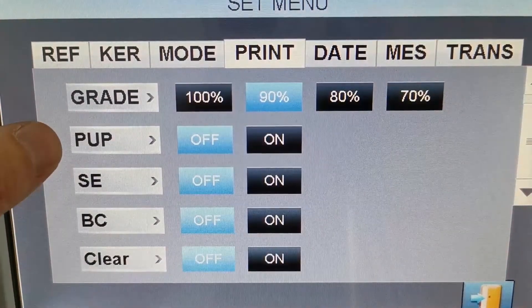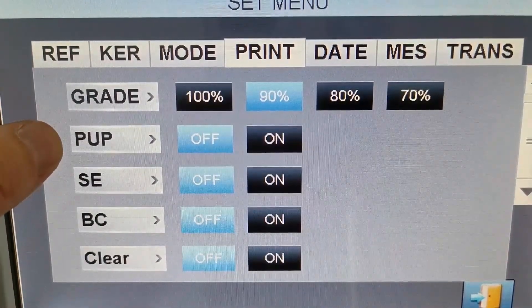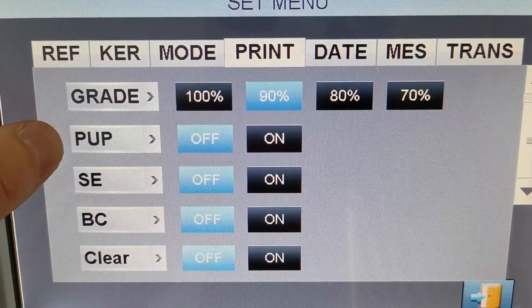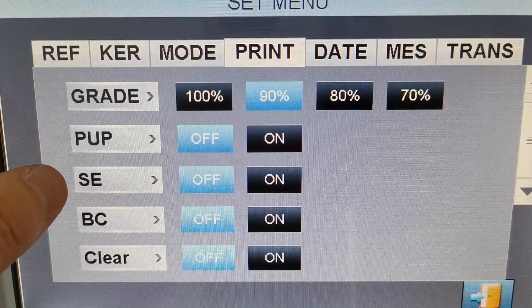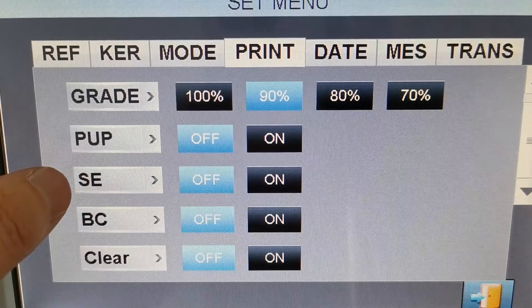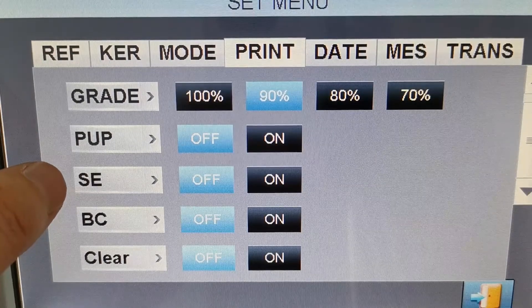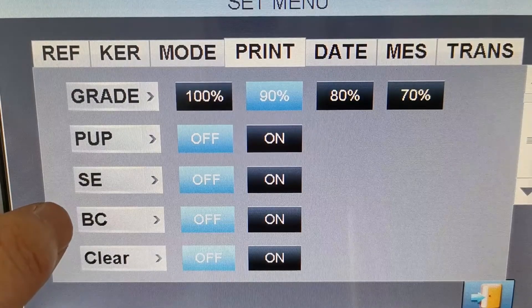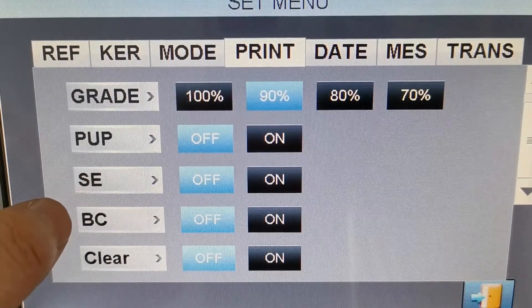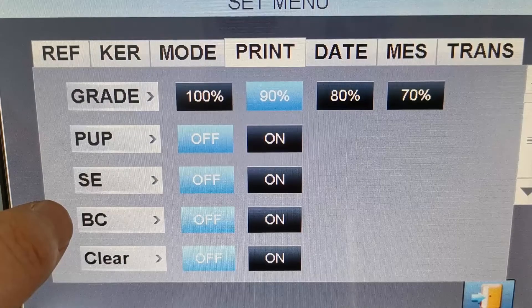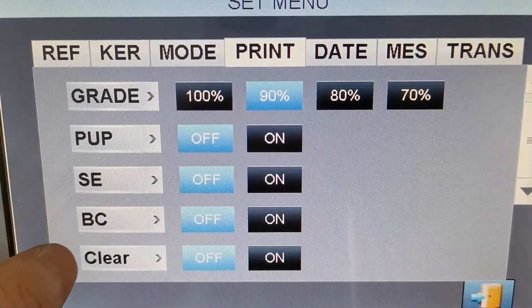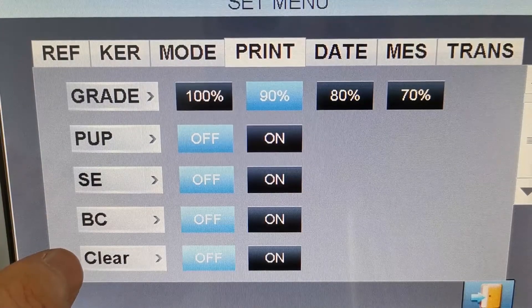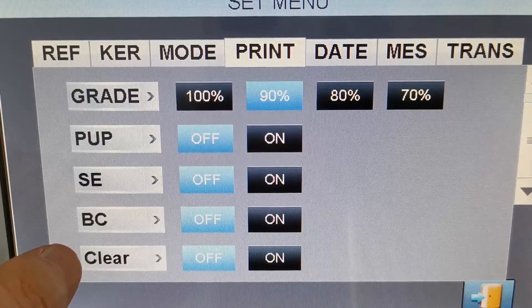Here is to print the pupil distance data or not. And this is for the spherical equivalent data. This is to print the base curve or not. And this is to clear all the printing data or not.